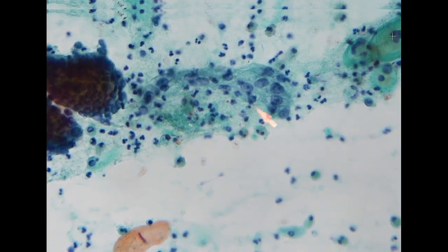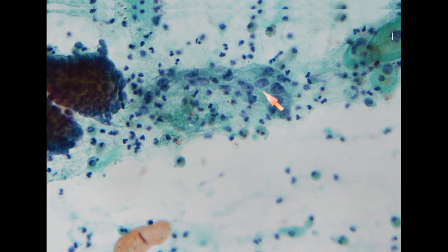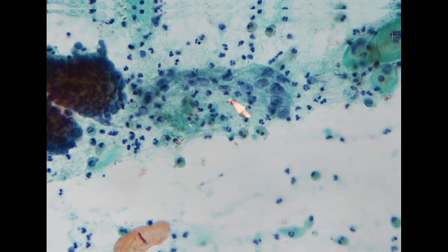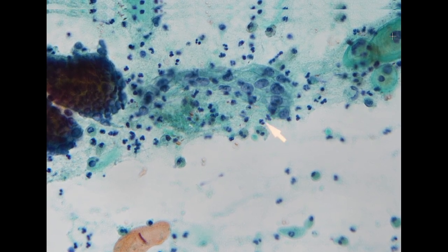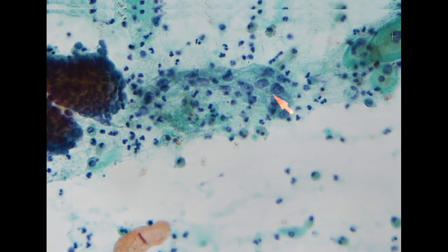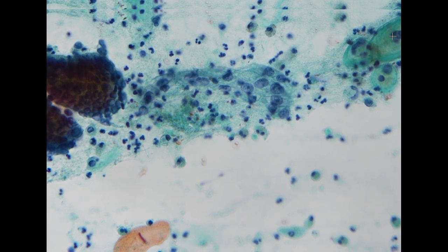So right next to it, despite this being relatively indistinct, you can tell that this cell looks atypical, with prominent nucleoli, and is admixed with necrotic type of debris. So these are abnormal, and whenever glandular cells present with nucleoli, you need to think about the possibility of invasive adenocarcinoma. So we checked the history.